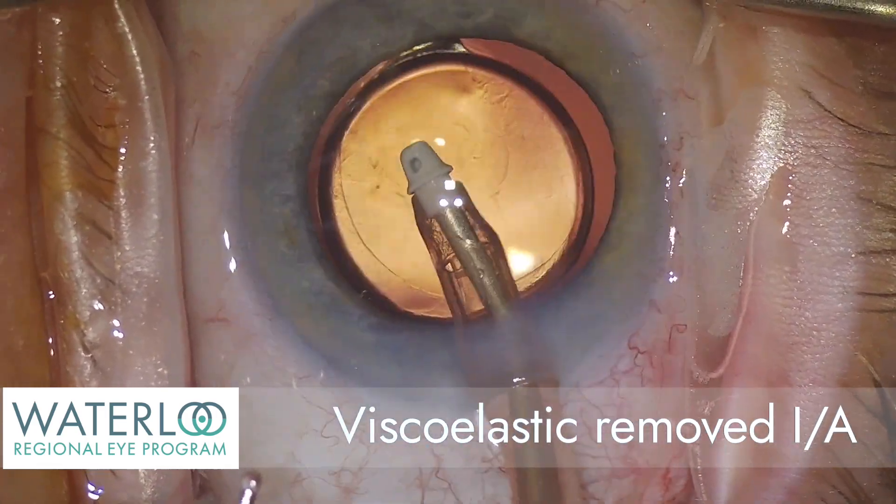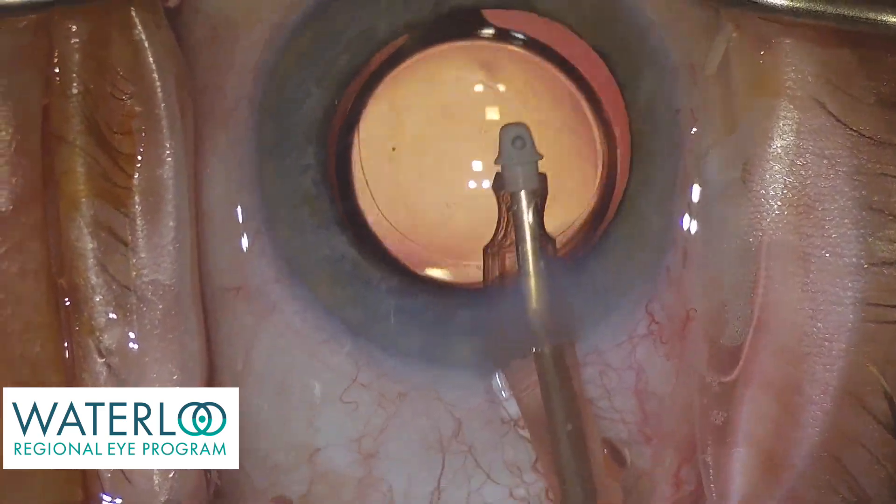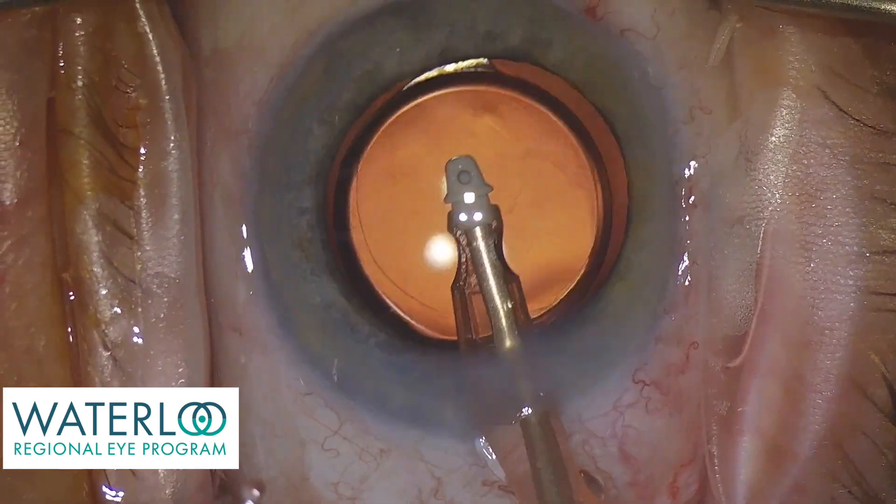The viscoelastic, the supporting material used during the case, is now removed with aspiration and irrigation fluid.